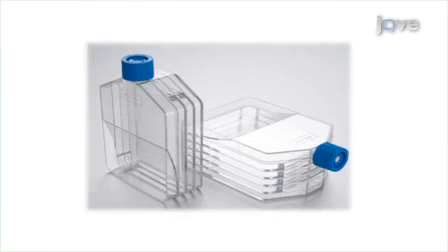Multi-flask cell culture vessels are available in a three or five layer stackable format for scale-up of cells, providing 525 and 875 square centimeter growth surface areas respectively.